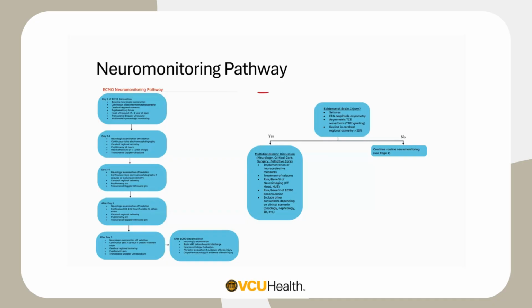And we have a discussion about a number of different things, and that is like, okay, is this patient safe for imaging? Yes, no, how can we do so? And if not, what do we do about that? We also have discussion about ECMO decannulation.